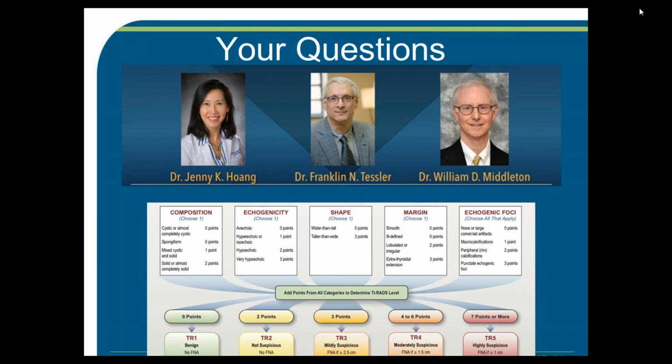Franklin and Bill, do you have any comments that you've heard about people adopting ACR TI-RADS, whether they've struggled, whether people have been on board, whether they've adopted and then reversed back? I'll take this. This is Franklin. I haven't heard anybody who's done any backsliding. I have heard from several people that it was harder than they thought it was going to be. So I think you have to devote the time and be patient.